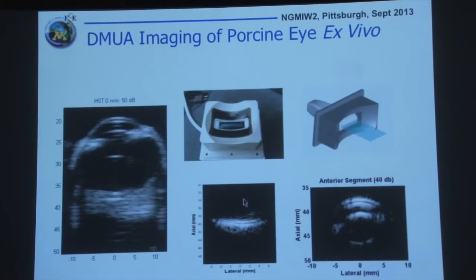So this is just to draw your attention, and maybe the community's, because I've gotten some pushback on this, where this may have to be deconvolved to get the actual structure. But I can assure you, and this will be demonstrated hopefully sooner rather than later, that this is the layer structure of the retina, a retinal surface. And you can see three layers, actually. We can argue that these may be the retinal surface, the choroid, and the scleral behind. So again, I expect as we move forward, we'll process these, we'll show this without equivocation.